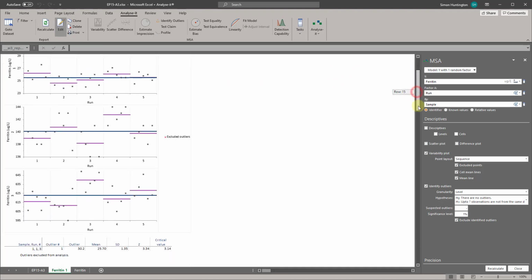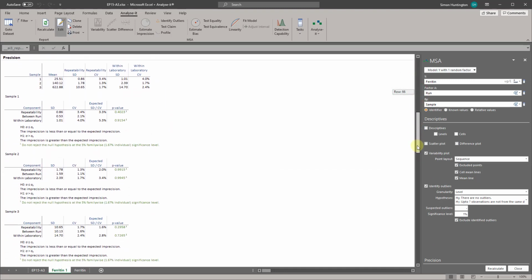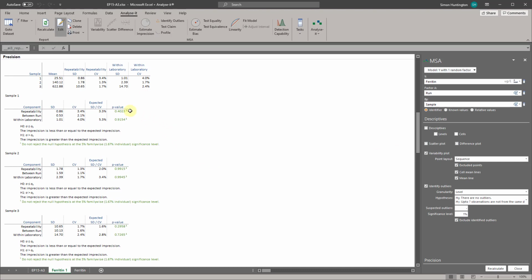The detailed variance components table shows the observed and expected SD, or CV, along with the hypothesis test p-value for each level. All the hypothesis tests are not significant and highlighted green. Because the exclusion of the outlier changes the outcome of the study, it is essential to investigate further to try and determine its cause, or contact the manufacturer for further assistance in diagnosing the problem.